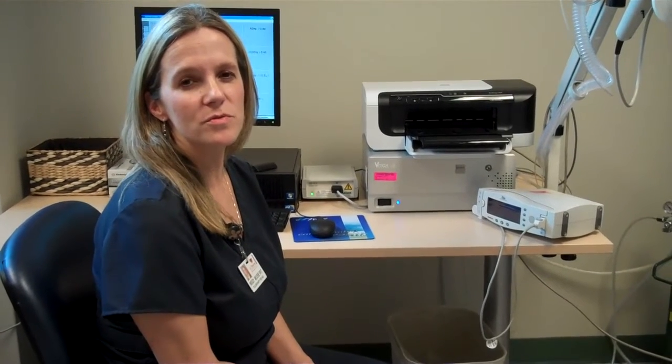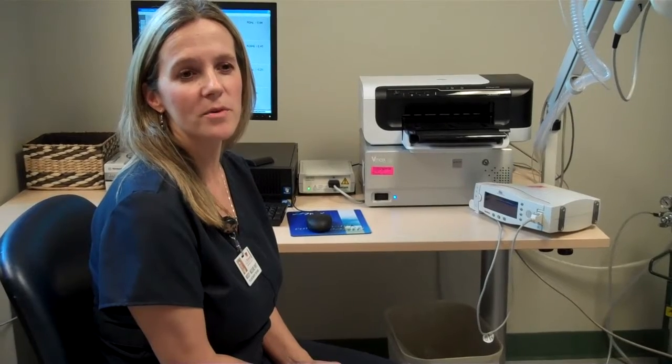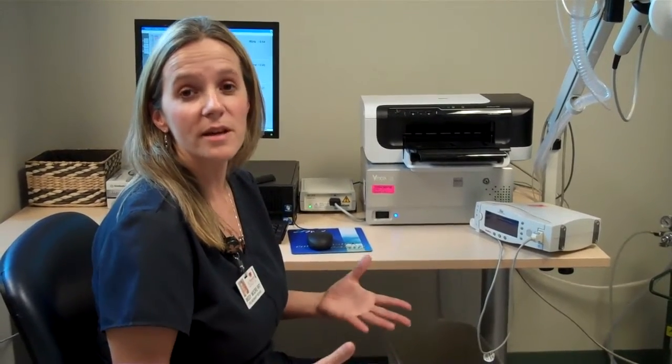IOS, the impulse oscillometry system, is a test used to detect lung disease. It's a much more sensitive test than spirometry. Spirometry is used as a pulmonary function test and is also a breathing test. It is used to detect lung disease.